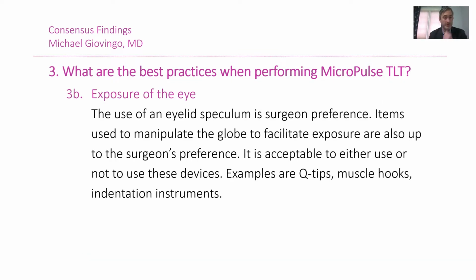Secondly, we looked at exposure of the eye. The use of an eyelid speculum is surgeon preference. Items used to manipulate the globe to facilitate exposure are also up to the physician's preference. It is acceptable to either use or not use these devices. Examples are Q-tips, muscle hooks, indentation instruments.